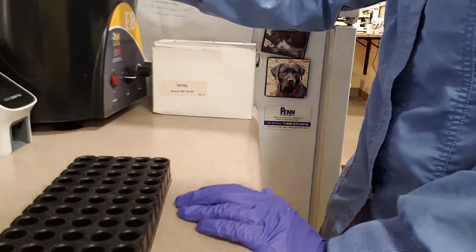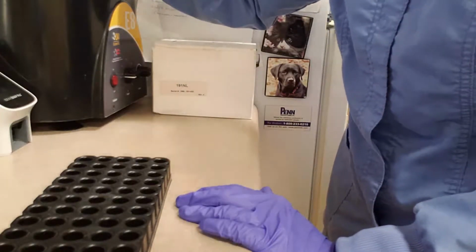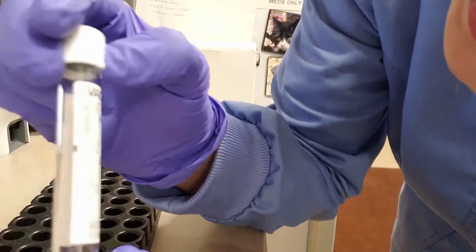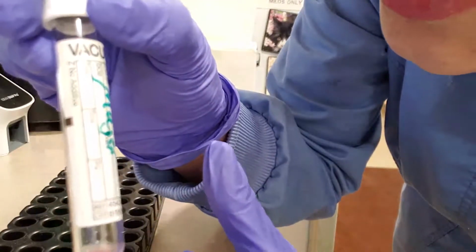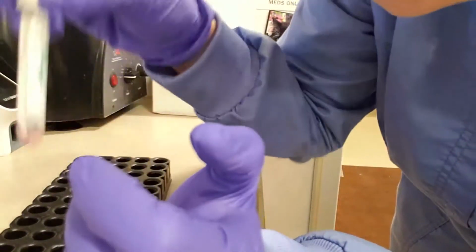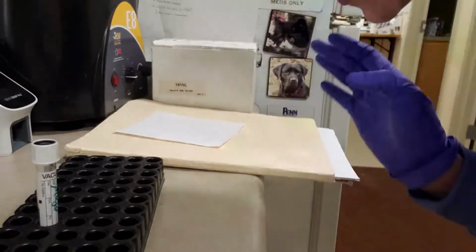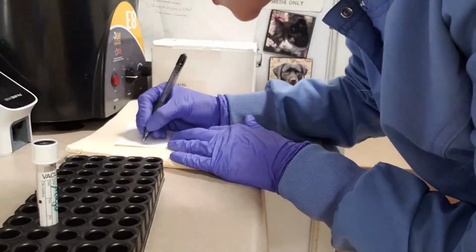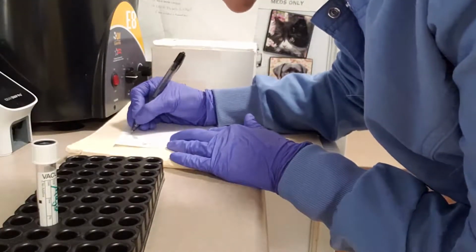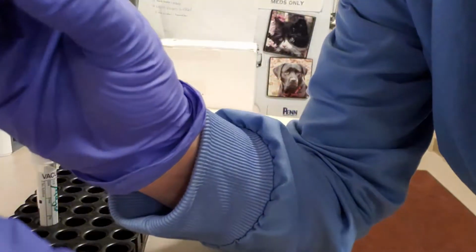Wait for it to slow all the way down. Okay, so first one is our major, and you can definitely see some agglutination there. You can see the red blood cells clumping together. So we'll put that there. And then we will write in our record, which doesn't fit on camera. Let's grab that. Okay, so we'll keep track of our observations here so that we can transfer it to our record. So we'll write major. We saw macroscopic agglutination.